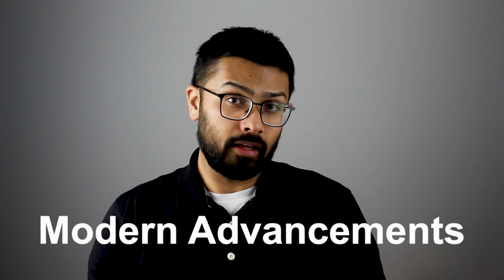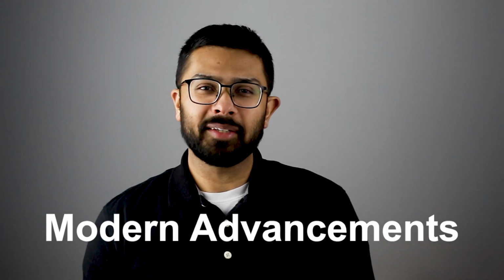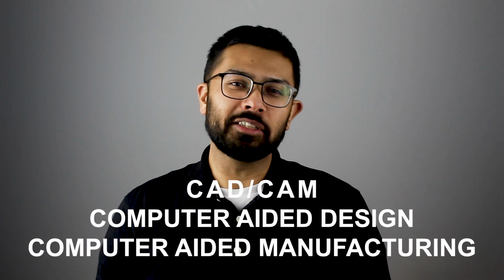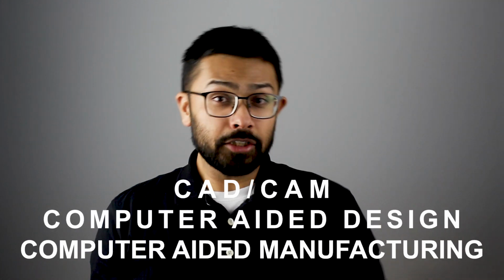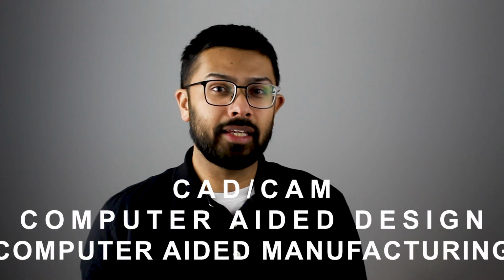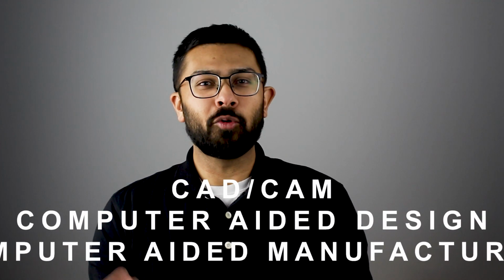Now let's talk about modern advancements in casting. While traditional casting methods are still widely used, modern digital technologies are transforming the way we fabricate metal restorations. Two of the most exciting advancements are CAD/CAM, which is computer-aided design and manufacturing. Digital impressions and milling techniques allow for faster, more accurate restorations with minimal manual intervention.